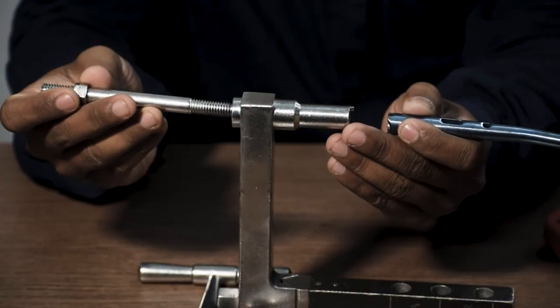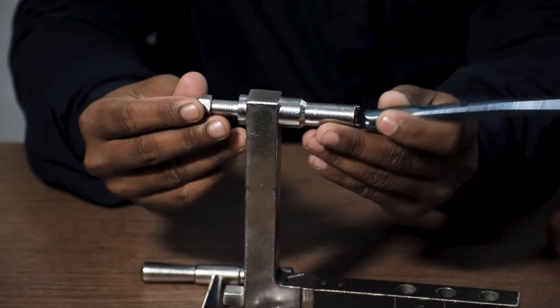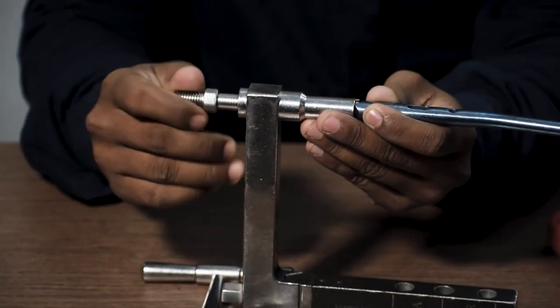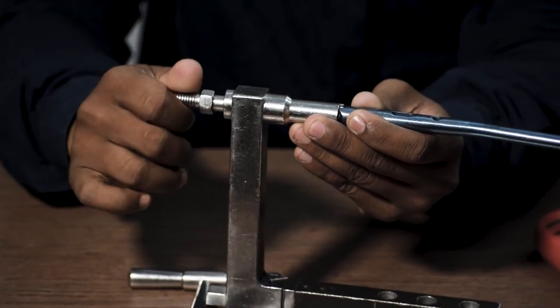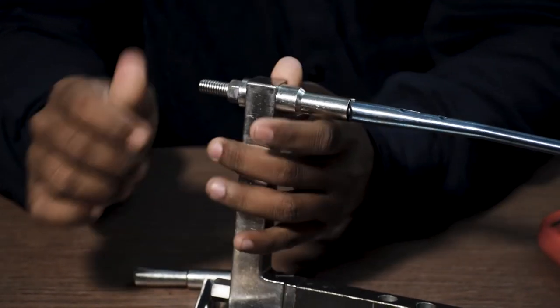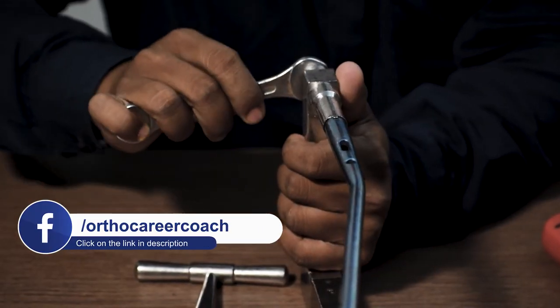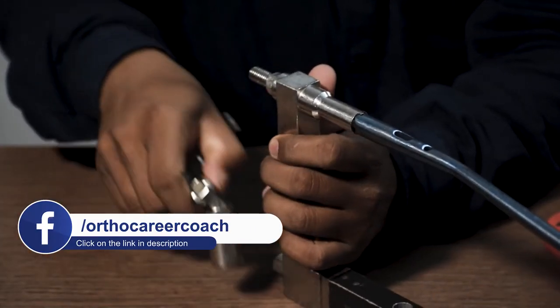Now let's see the nailing procedure. The conical bolt is attached in this place of the jig. After the entry of the conical bolt, we attach the nail on this side and then tighten up. Spanner or box spanner is used to tighten it furthermore.